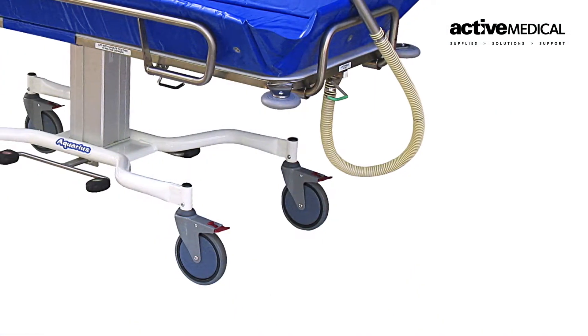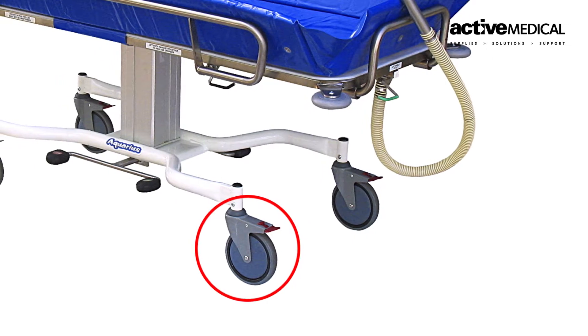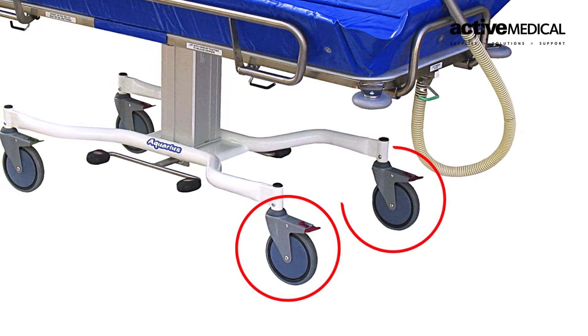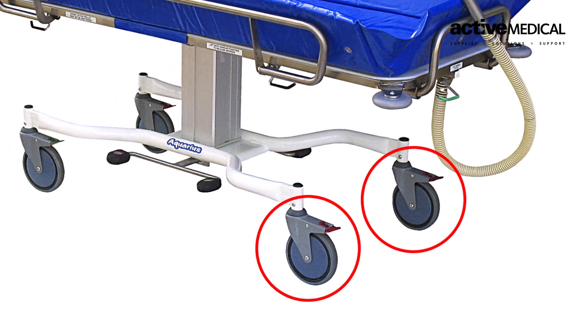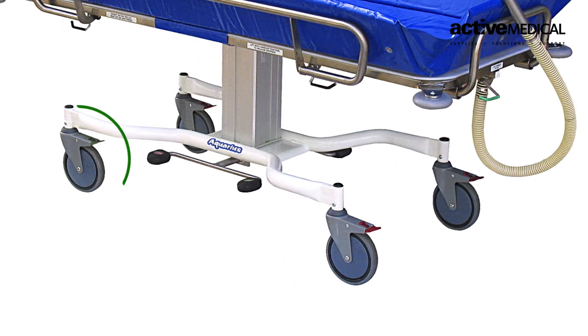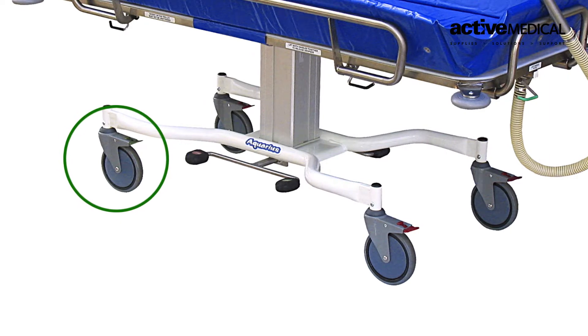You'll notice the different color caster tabs. We have the red tabs, which are the braking casters. Always ensure staff apply two or more braking casters when using in a wet environment. We also have the green tab, which is your directional caster — very good for manual handling and ensuring staff are kept in a safe position when pushing the product.